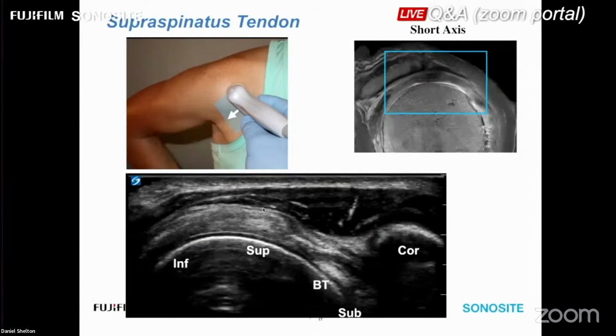And we can see this rounded oval of the supraspinatus. It's cut in half. This is your sagittal MRI equivalent. Here's the coracoid process as a landmark. So the medial side of the transducer, screen right, is the patient's medial side, just under the fingers of this photo, and that's where the coracoid is going to be. And then what you're going to do is just windshield wiper over until you see the humeral head typically.